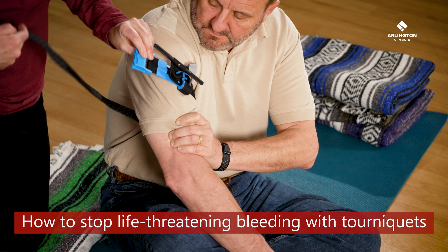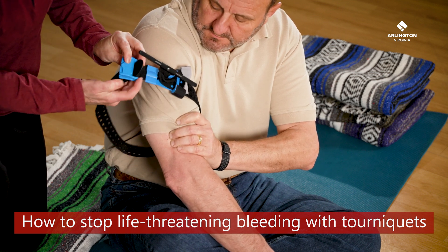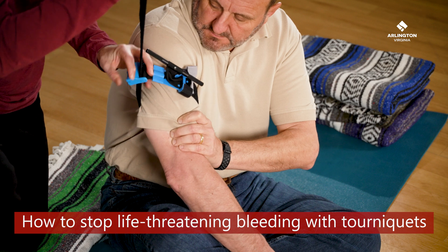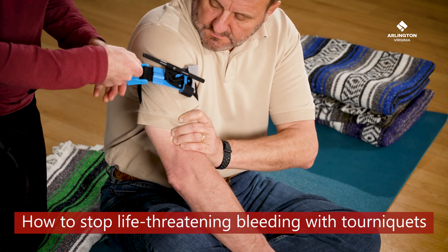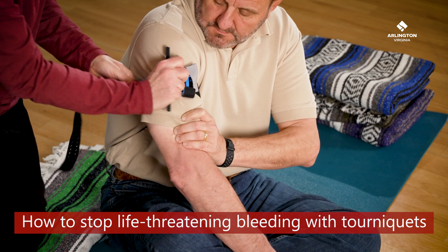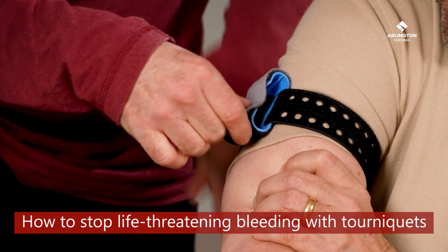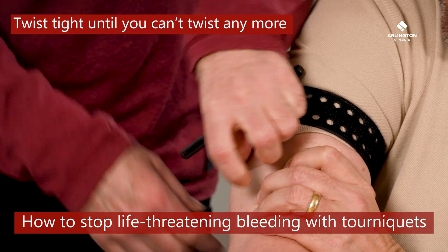To use it effectively, pull the strap through the buckle as tight as you can before you start twisting. This tourniquet is called a SAM XT and has teeth that click through the holes in the strap when you have pulled it tight enough to start twisting. Once it's set tight, twist until you can't twist anymore and secure the windlass.